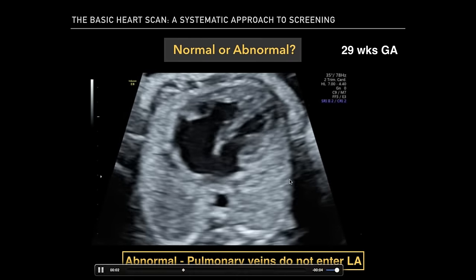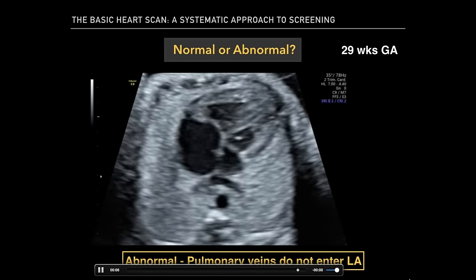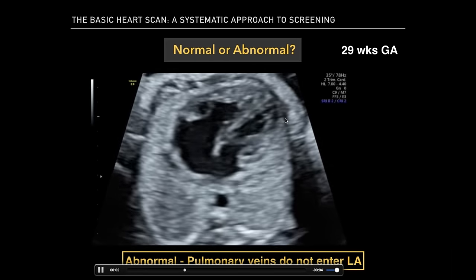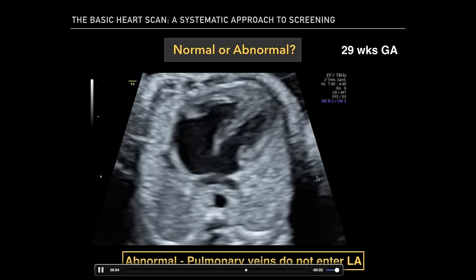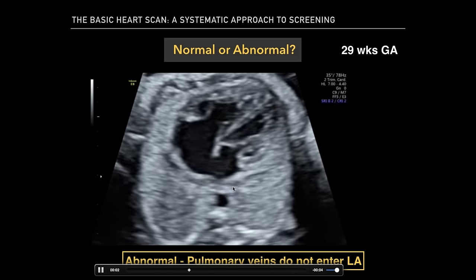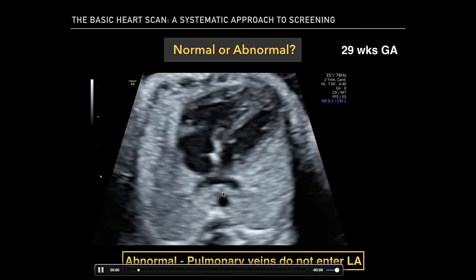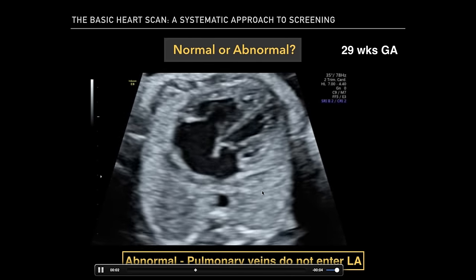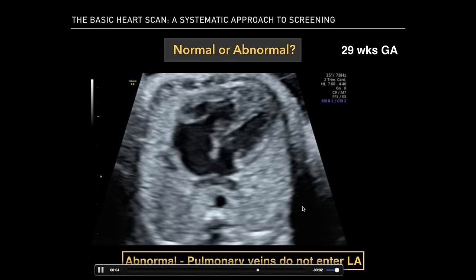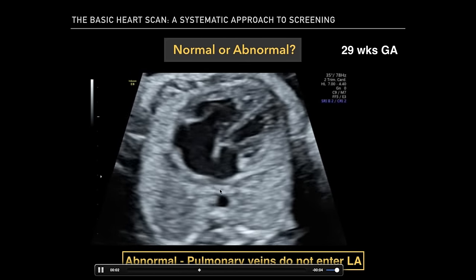Now, what do we actually see here? Is this normal or abnormal? Just to let you know, this clip was purposely slowed down. We see what looks like pulmonary veins right behind the left atrium, but there is the presence of a confluent vein behind the left atrium. Also, if you notice, there is an increased distance between the descending aorta and the left atrium.